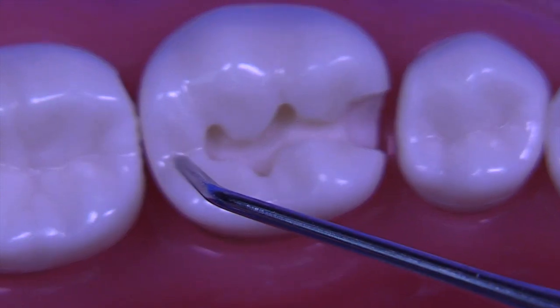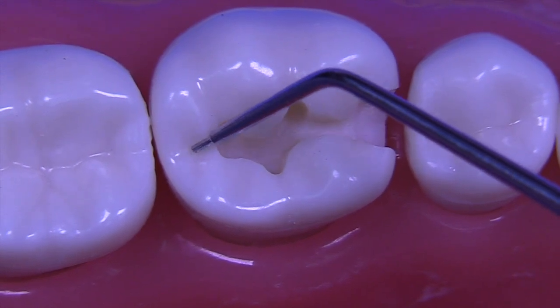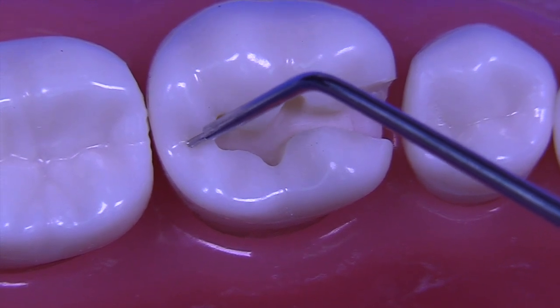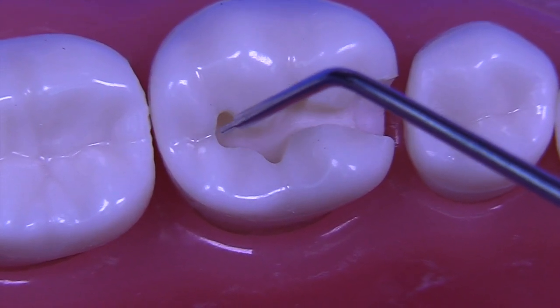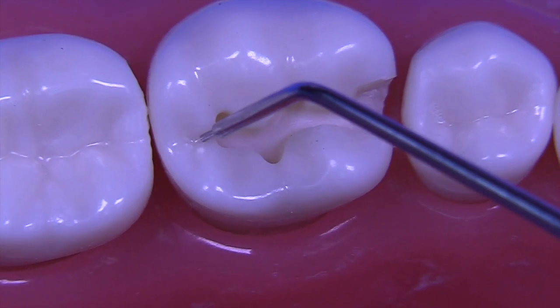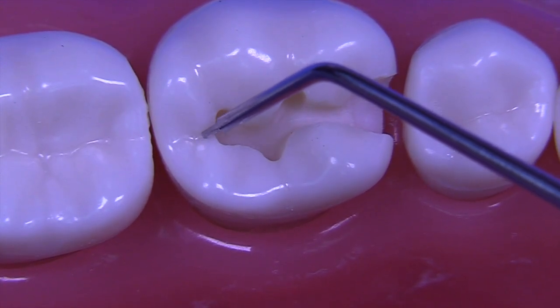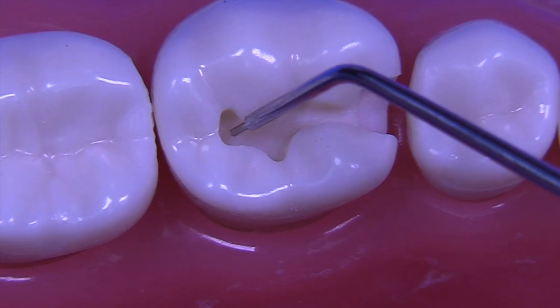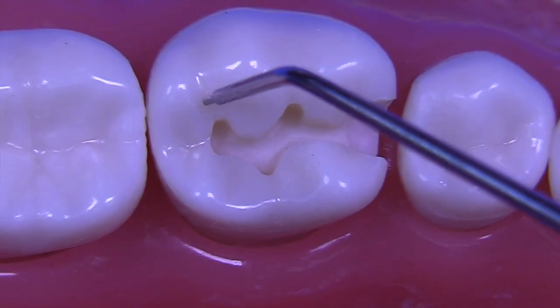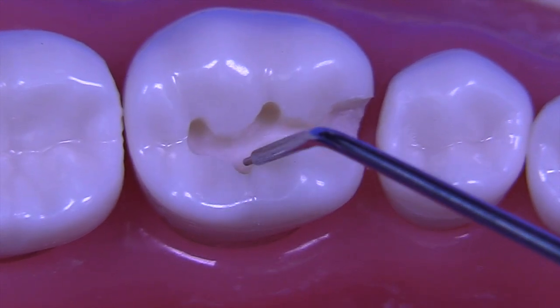And we can see here that we do have a pit on this tooth, which extends in this direction, which was not included. This would be the location typically of a second distal pit. And I would have included this area. So I would have had the little dovetail more of a fishtail shape. So I would have had it go into this area and not into the middle of the triangular ridge of the distal lingual cusp. On the facial, you did a nice job following the facial extensions and the lingual extension.